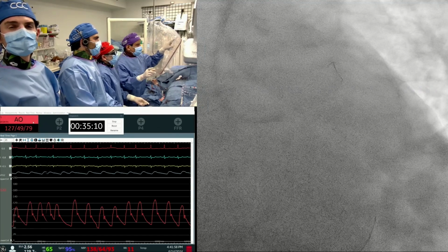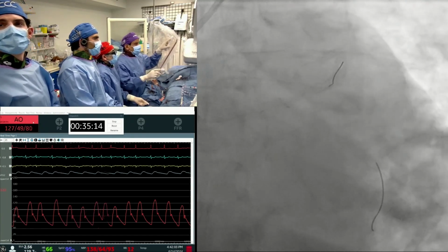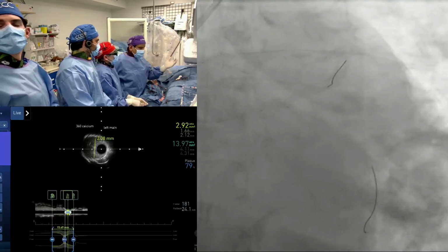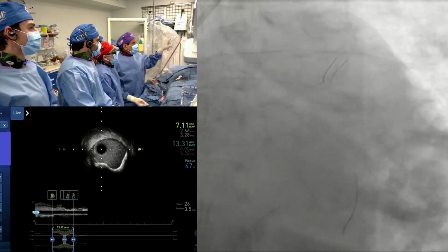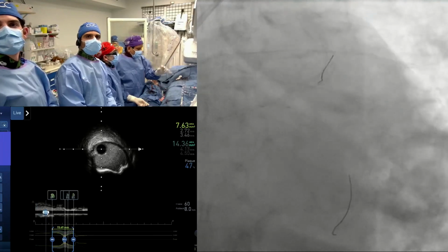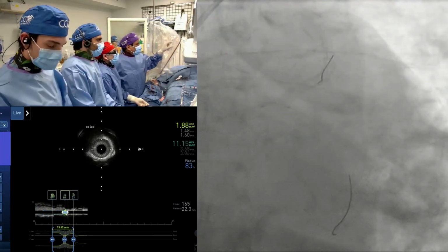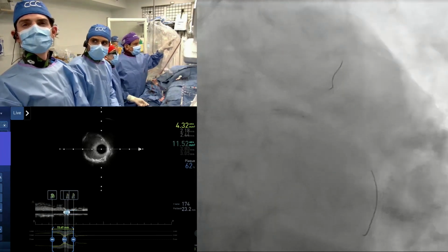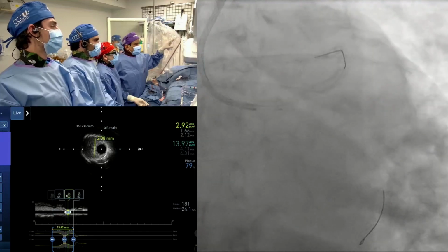So because everybody would like to see the IVUS, we have done the IVUS and also the ostial circumflex, where I used a 4-row Scoreflex. We have the AngioSculpt Scoreflex, a scoring balloon, or the Wolverine, which is the typical 3 or 4 blades. This is 1 wire and 1 blade, kind of your own wire, so 2 wires, and you can go to very high pressure because it is non-compliant. So here we went to 20 atmospheres, as you hear.